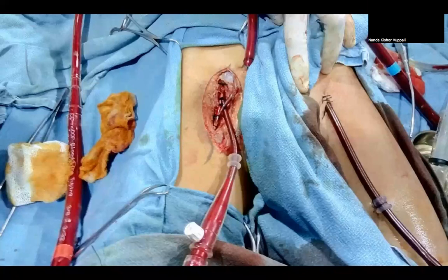This is a pediatric patient who went on veno-arterial mode of ECMO for viral myocarditis. This is a drainage cannula which is put in by the percutaneous method, and this is a return cannula which is done by open cut down, by surgical cut down. So we cannulated the femoral artery. Because we cannulated the femoral artery, we worried about the distal perfusion of that leg. To prevent distal perfusion problems, we put another cannula to maintain the distal perfusion. This distal perfusion catheter is again connected to the main cannula through a Y junction, which is not shown here.